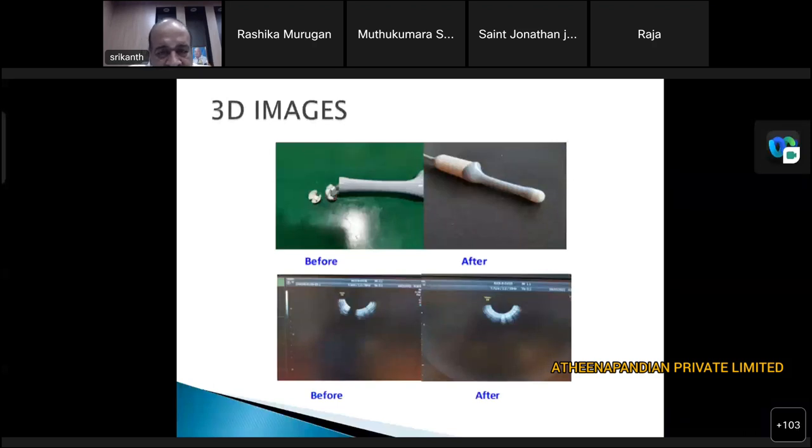See, these are some parts of it. This first image shows it was cut, and there is a motor inside which has fallen down, so the image will be like this. You can see both the images. The first is the physical image of the probe. The second is the image after putting it together properly and putting the oil in; the image after is clear. Next one.